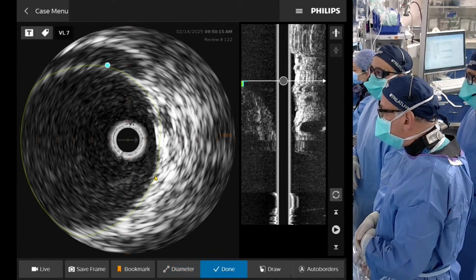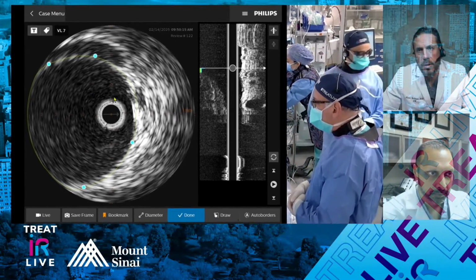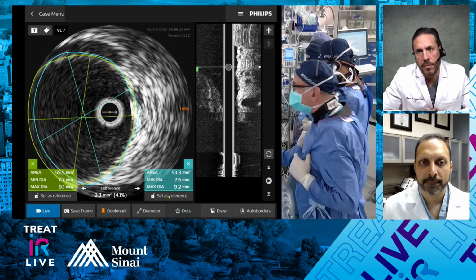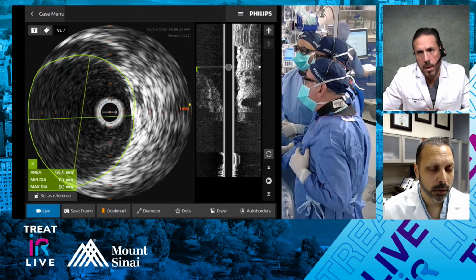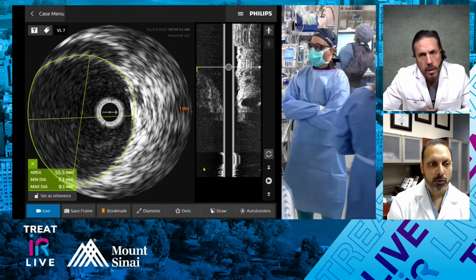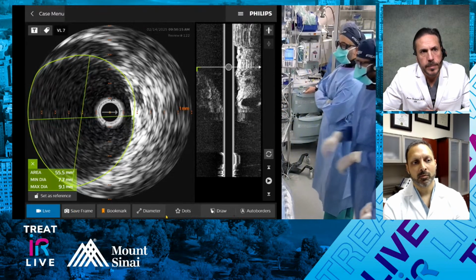Yeah, so I think that's a really good point. If you pick the right stent size, you should be able to do the entire angioplasty and stenting with one device and not have to switch balloons. I mean, it's not a big deal to switch balloons in cases like this, but it definitely creates a bit more work, and multiple exchanges just increase the likelihood that you might have an issue. What do you think about that, Parag?